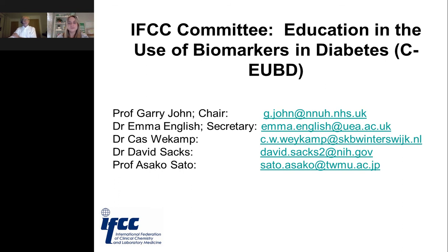Yes, I think so. From the slides we saw from the Euro A1c study, we have seen the standardization has resulted in overall improvement in the accuracy, with major manufacturers achieving values well within bias targets. And this has been a huge success for standardization and a huge improvement in the situation, which I'm very pleased to have been involved with.